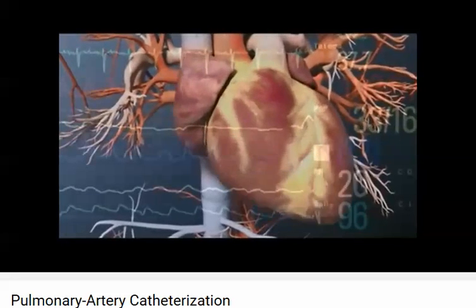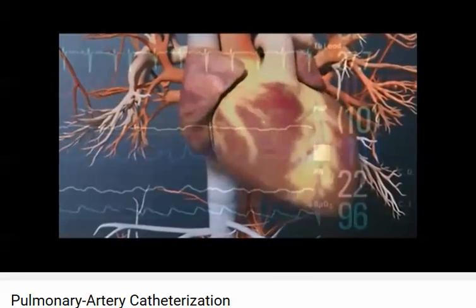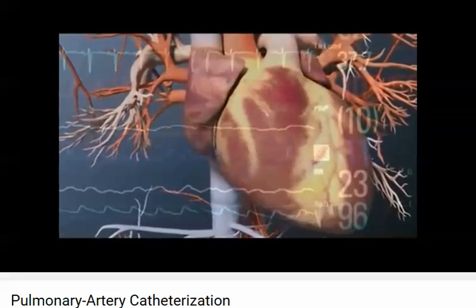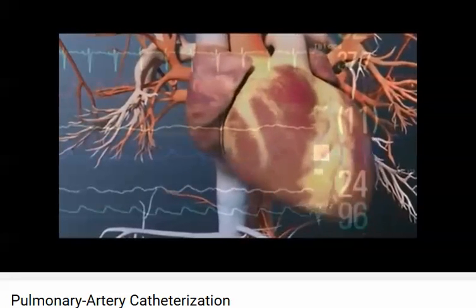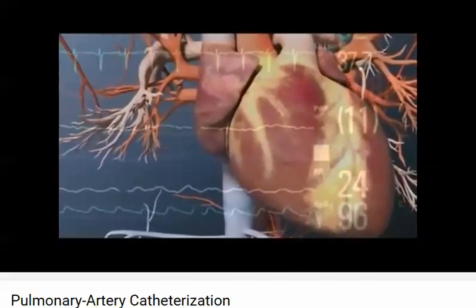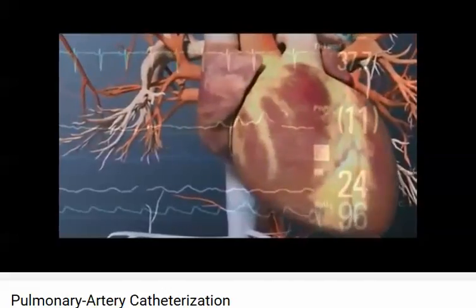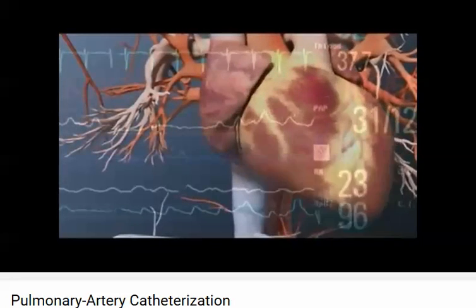Pulmonary artery catheterization yields hemodynamic data that may facilitate the diagnosis and treatment of patients with a wide range of cardiopulmonary conditions. When appropriate precautions are taken, the procedure is generally safe. However, all providers must be aware that because fatal complications can occur, the procedure should be performed only when the results are expected to aid clinical management.